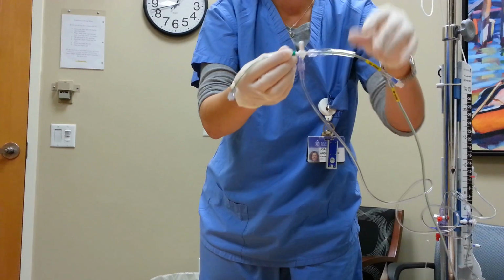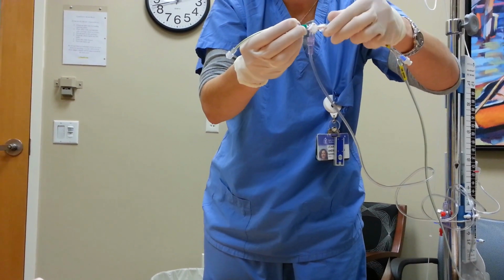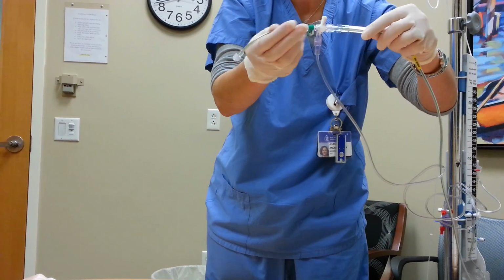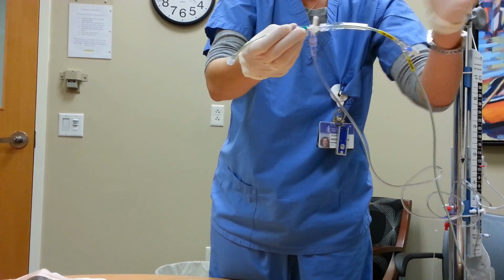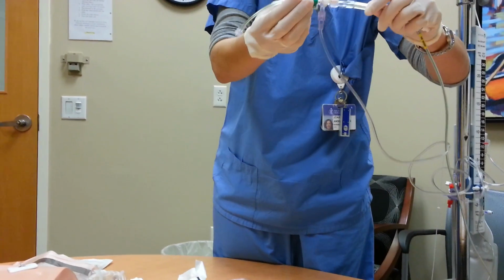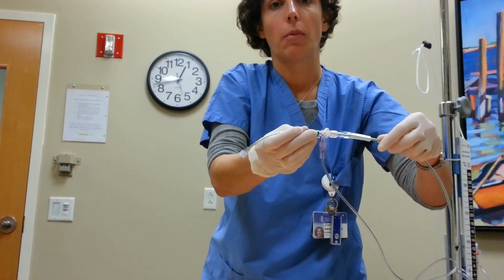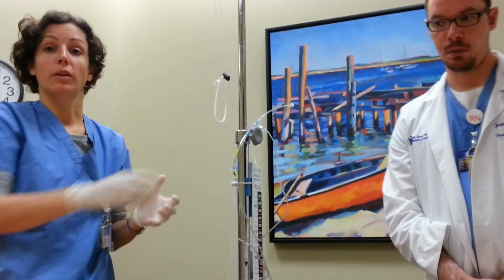Sometimes you may find that when you have the transducer open this way and you close it, it's the same pressure. That's typically the situation if it's a low pressure situation. If a patient truly has a high ICP, what you might find is the ICP may read 6 or 7 right now, but if you close it off to get the real ICP, you may get as high as 30. So it's important that you really get that real ICP that way. I think that's it for setting it up and transducing a pressure.